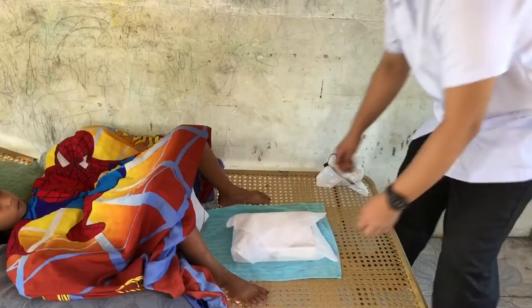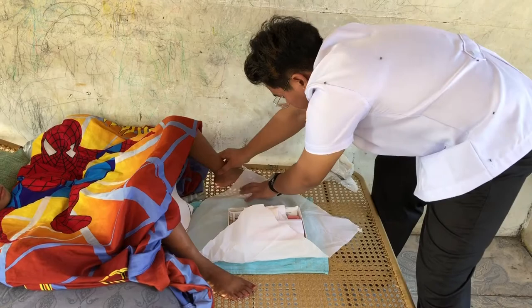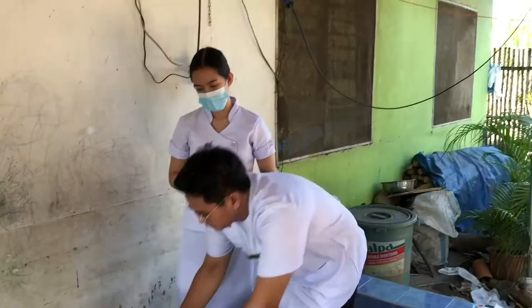Wash hands. Open sterile pack — grasp its corners and open it with care, touching only the underneath sides and edges. Bring edge of cover under buttocks if able.